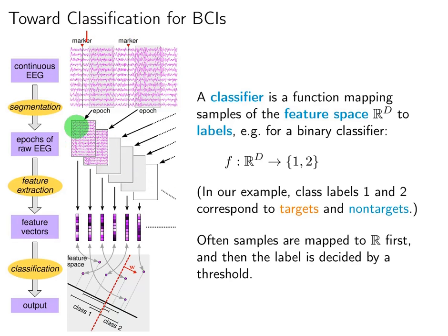From these epochs, we need to do one more step of pre-processing, usually cleaning background irrelevant noise in the data, and construct the feature vectors from epoch 1 to 12 feature vector. And finally, we apply the classifier, either binary or multi-class, depending on the type of classification we're solving in the BCI context.